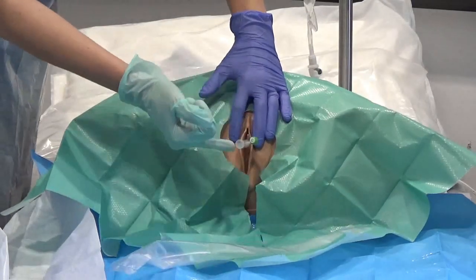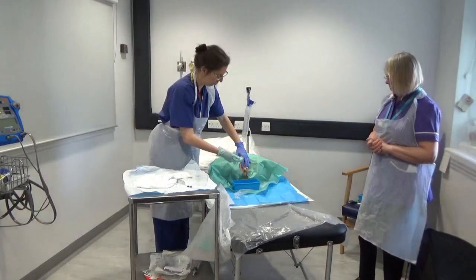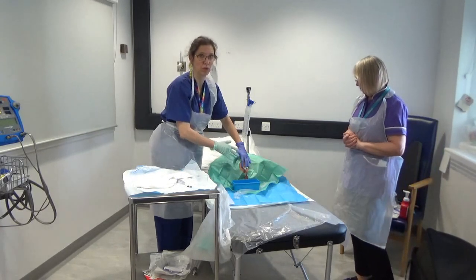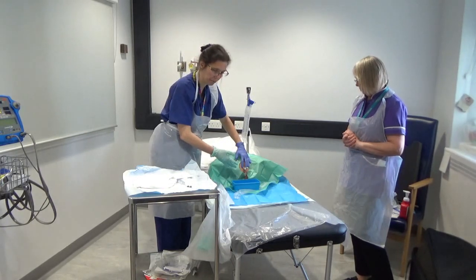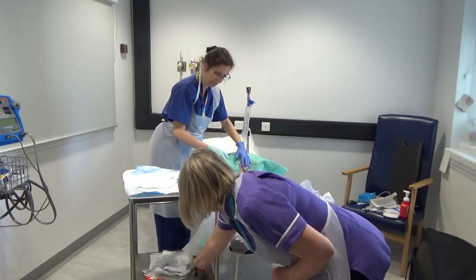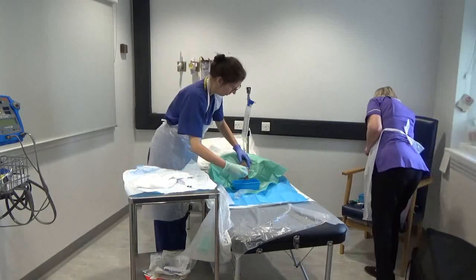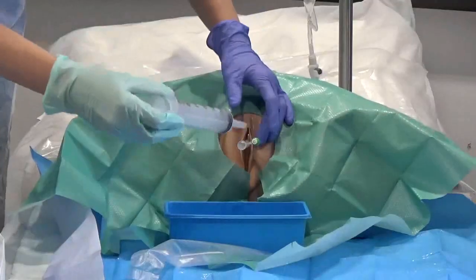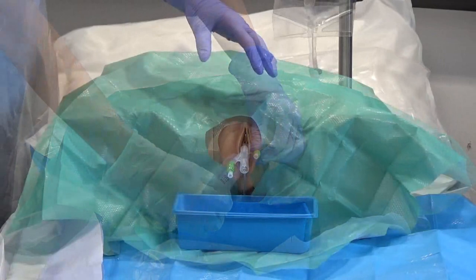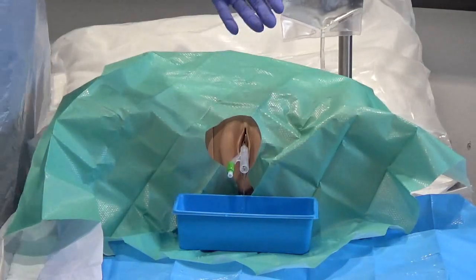Regardless of whether you see urine or not — and I don't see it, which may mean gel has blocked the catheter — you insert the catheter fully to the bifurcation. Normally there would be free-flowing urine and I'd put the receiver underneath to catch that. To fix the catheter in place I would now inflate the balloon, but since I haven't seen any urine I will never inflate the balloon without confirming position. So I ask my assistant for the bladder syringe. She opens this sterilely and I insert it and gently aspirate — and there it is. After a little bit of aspiration, there is now free-flowing water coming out. This is what you want to see — I now know I'm in the right place.